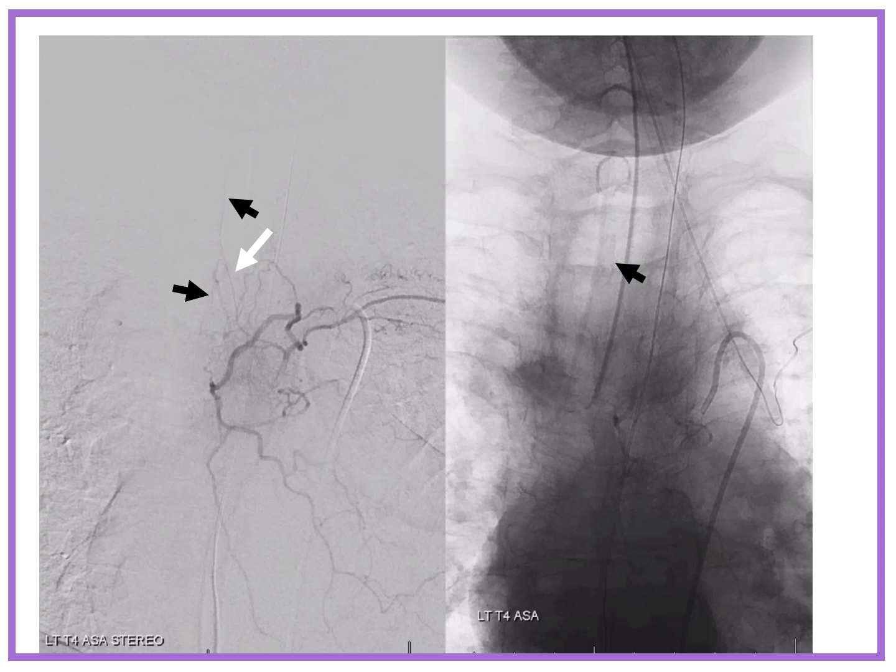Well, fine. So where's the rest? We still haven't seen the middle, the thoracic area is still missing. So here, what to do? Well, we have to have the courage of our convictions, right? We can't just assume that it's not there or it's filling through some collateral or some other magical thinking that sometimes is entertained. No, there's no magic here. It has to come from somewhere. We just haven't found it.